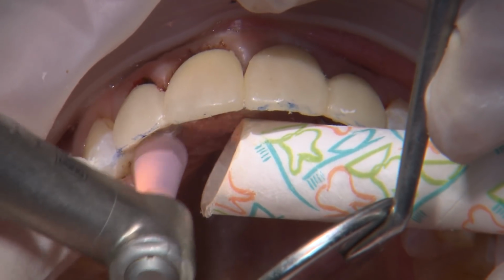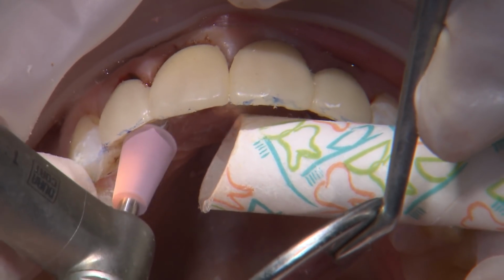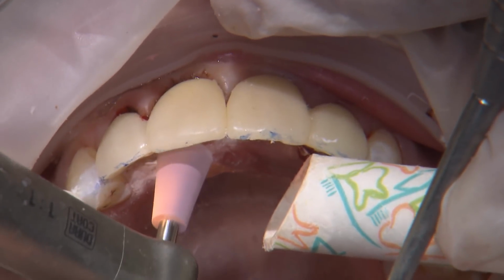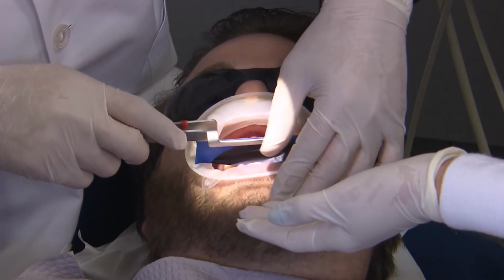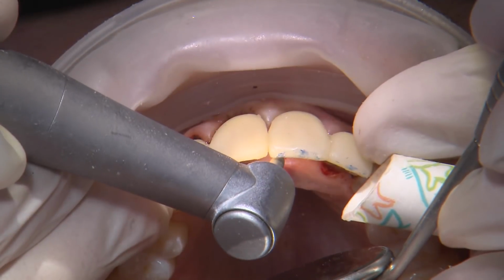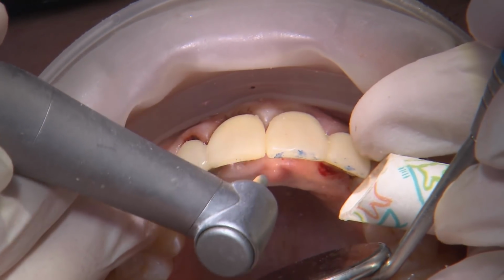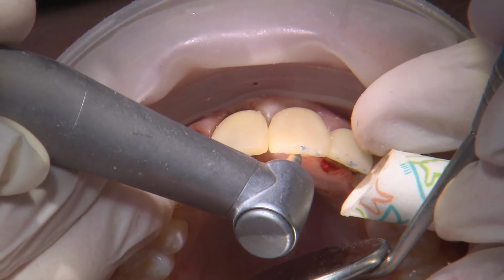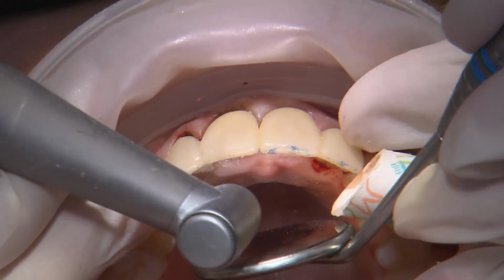After the provisionals are bonded into place, I'm smoothing out the lingual margins with a composite polisher just so these areas blend in really well with the tooth surface. I then use a fine diamond football to adjust the high spots on the provisionals, while carefully avoiding the tooth structure, which could certainly alter the margin position.